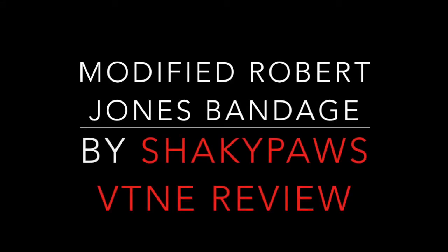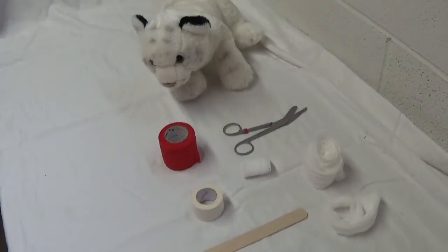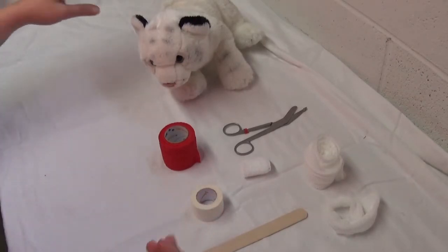Welcome to the first video in the series of veterinary bandaging techniques presented by Shaky Paws. The first bandage we're going to do is the modified Robert Jones, which most bandages are actually going to be a modification of. This is a really good bandage to have in your repertoire.